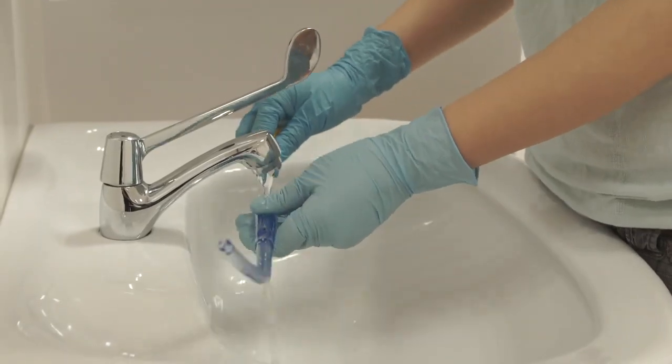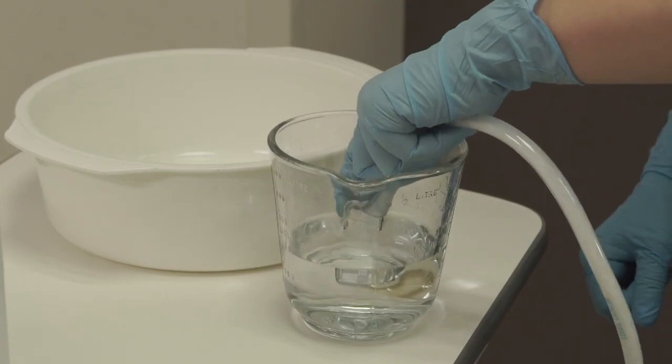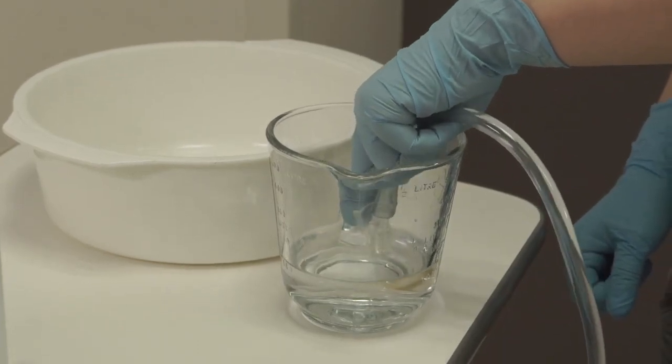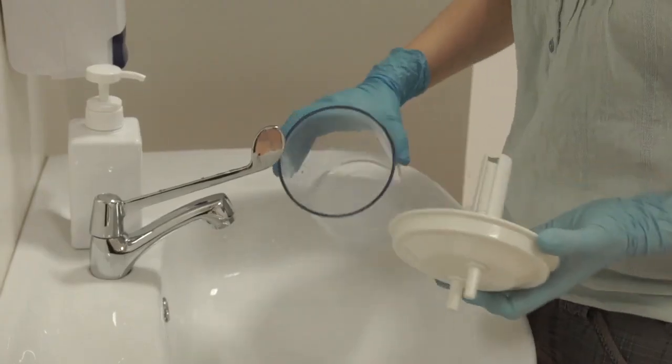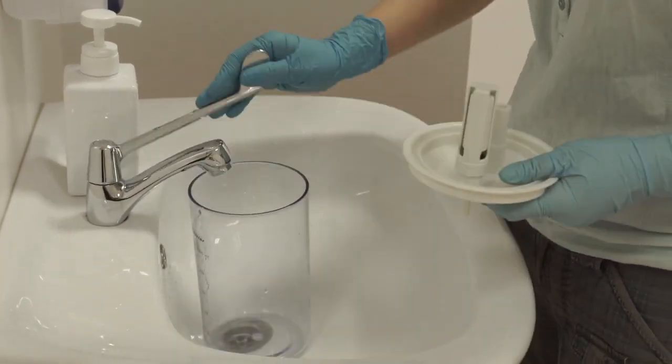You may wash and reuse the Yankauer catheter. Flush the tube by dipping the tip in cool, boiled water and suction until the tube is clean. Pour away the contents and wash the container.